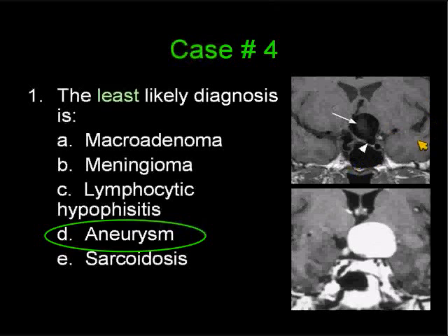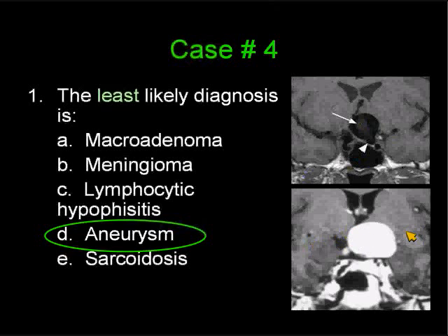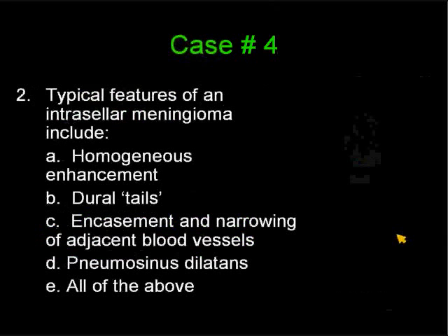In this case you see the neck connecting with the internal carotid artery, and you see the artifact of flow in the mid-aspect of the aneurysm where the blood is flowing a little bit slower. In this other case, there is significant and homogeneous enhancement of the aneurysm, but you can see the flow artifacts to both sides — something that can help you identify a vascular lesion.